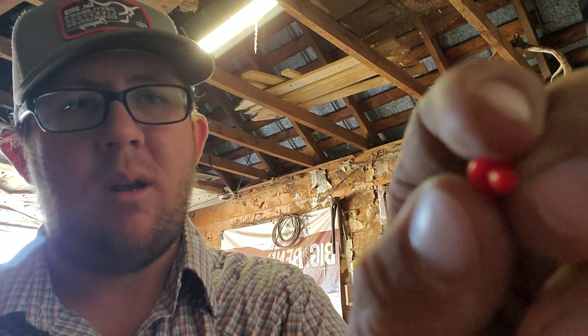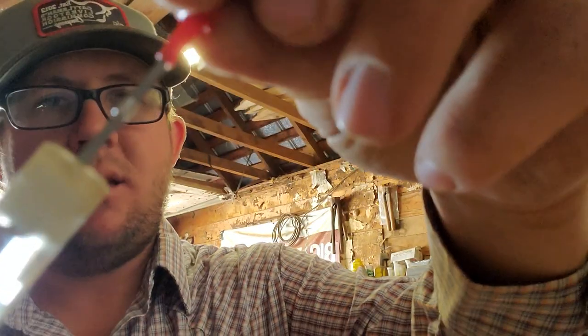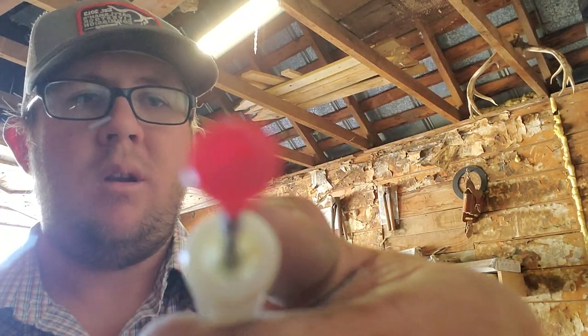You take this little red cap that is provided and just slide it onto the needle — you don't want it to puncture all the way through. Those caps stay on the needle and keep your medicine from falling out.